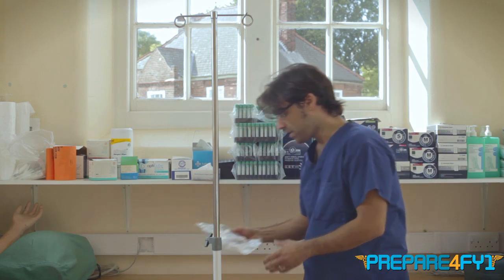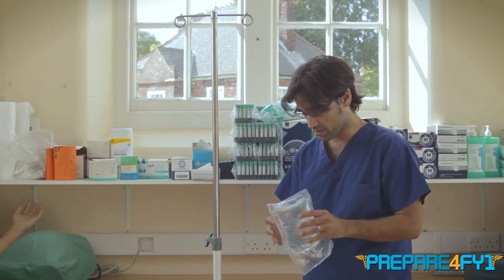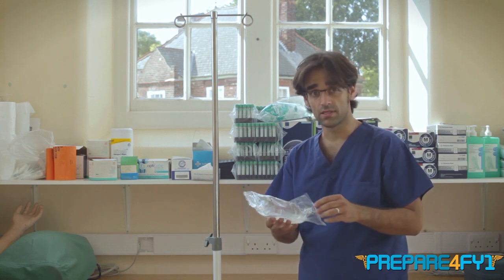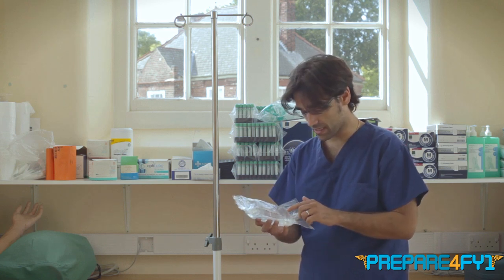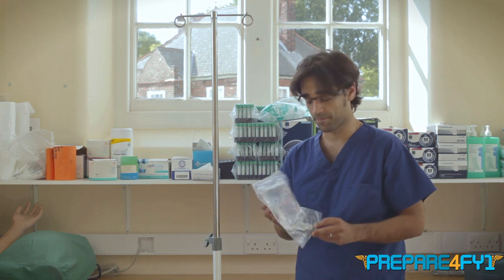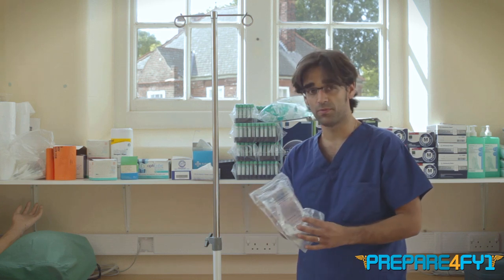When you have the bag of fluid, you need to check it for certain things. You need to check that it's sealed and hasn't been tampered with, that there are no discolourants or problems with the fluid itself, and also that it's in date — the batch number and things like that. This is 0.9% sodium chloride and it expires February 2016.